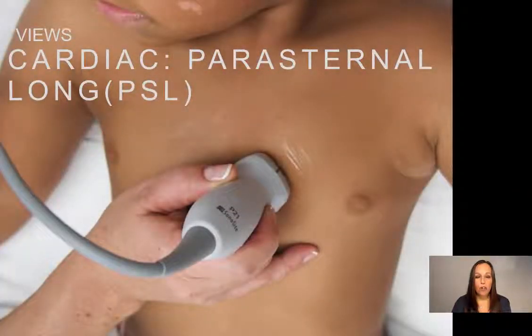Now, subxiphoid is a great view. It's relatively easy, but in some patients, it's difficult to obtain the subxiphoid view. Also, as part of the RUSH protocol, the parasternal long axis view is important, especially when we're moving on to evaluate for contractility of the heart.